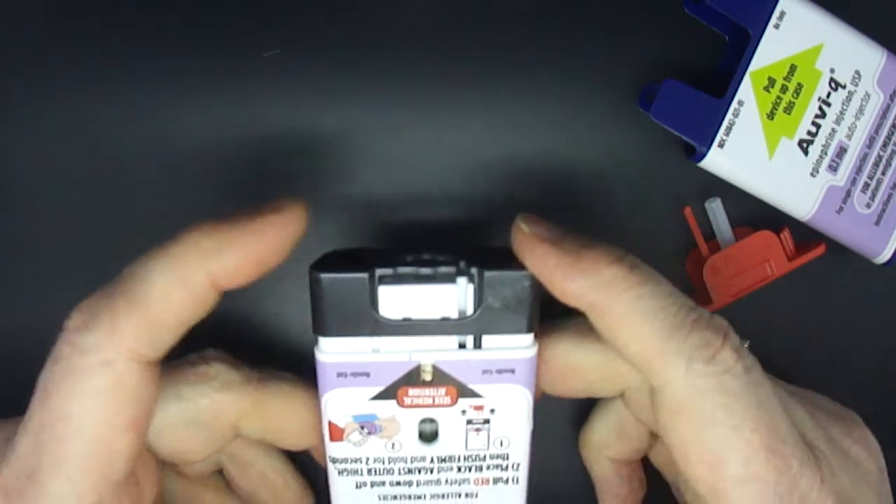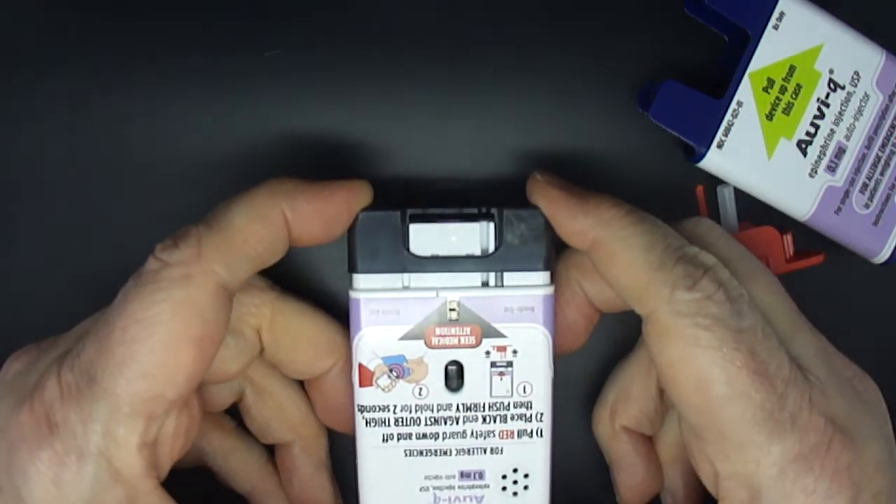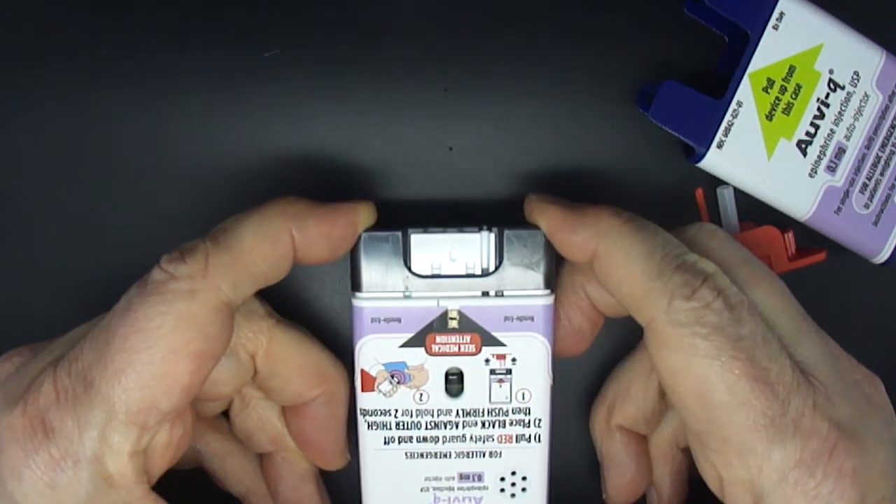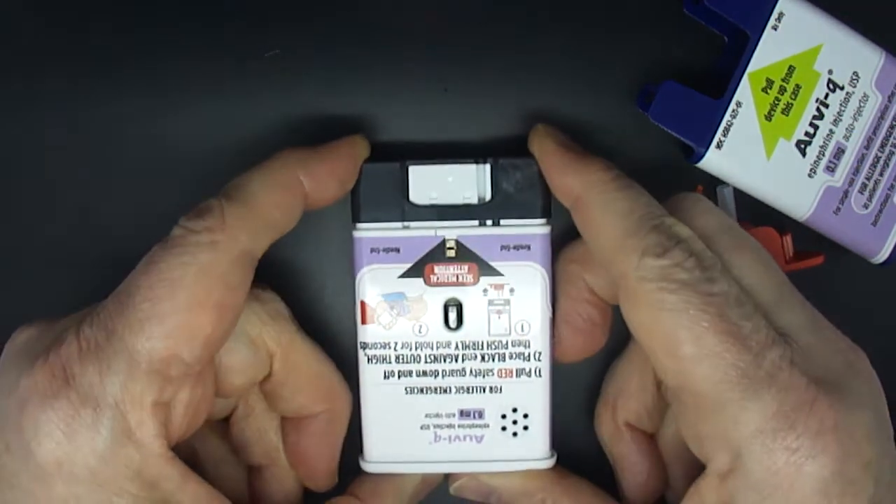Then push firmly until you hear a click and hiss sound, and hold in place for 2 seconds. 2, 1. Injection complete.